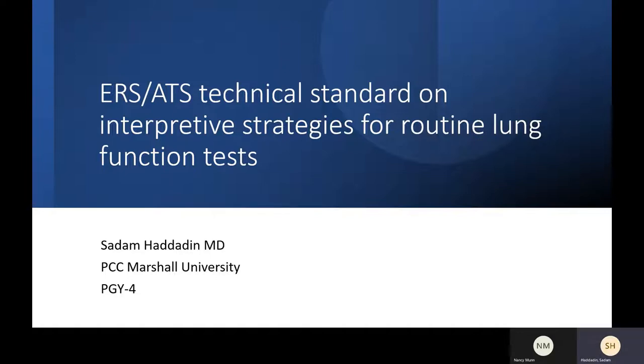Unless you say this patient has this much percentage of his age-specific group. So it's the age-specific aspect that is the most important thing that has brought this up, because our data since 2005 compares one patient to a whole group and uses percentages. Now we're comparing one patient to his normal group. Then this should resolve the conflict between ATS and GOLD.